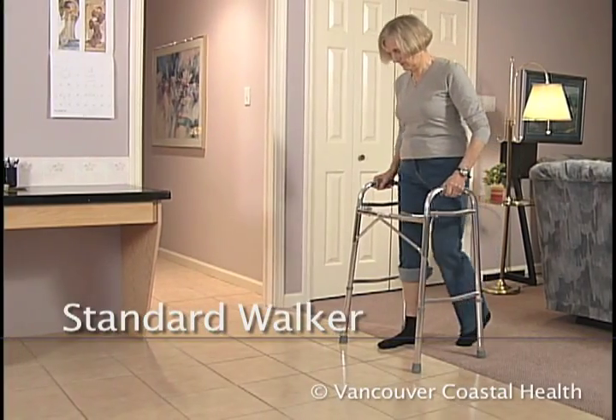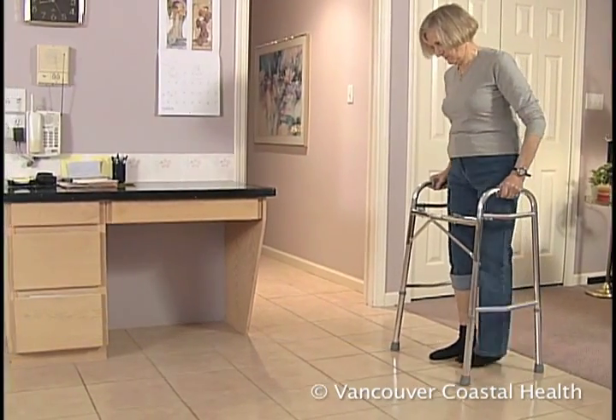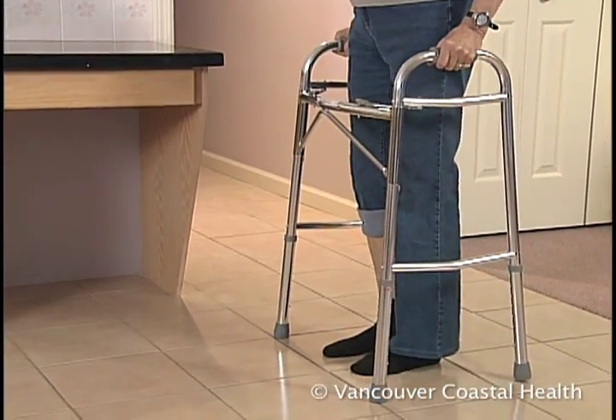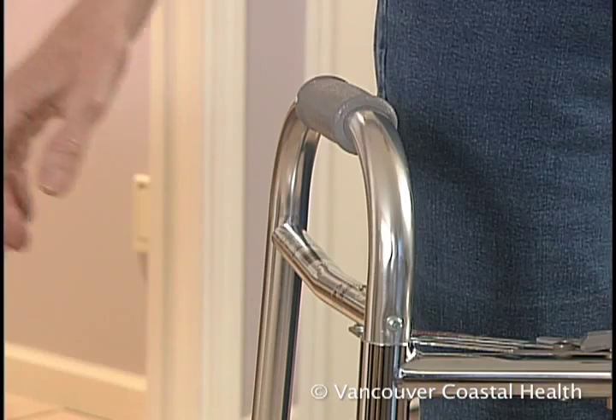Right after surgery, you may use a standard walker or a two-wheeled walker. A standard walker has four fixed legs and gives the most support. As with crutches, the walker height needs to be adjusted to fit your body.